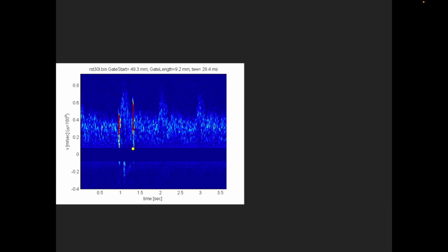Here we can see two other examples of microembolic signals arising from microemboli. They are shown as short-lasting, high-intensity signals within the FFT spectrum.